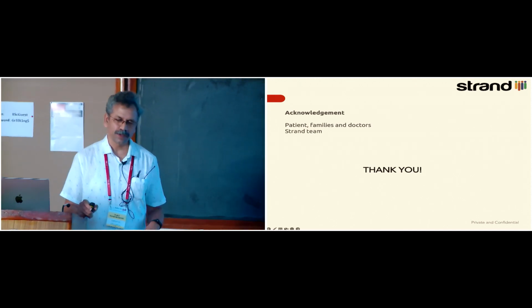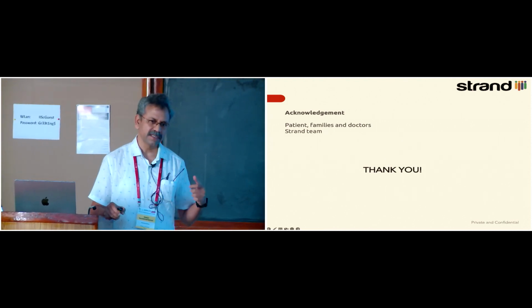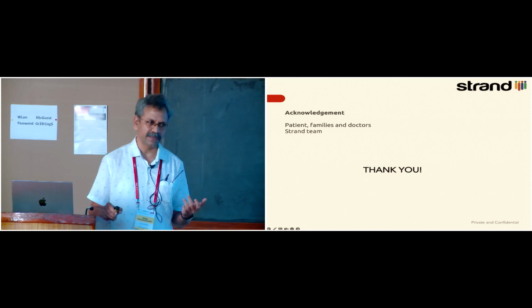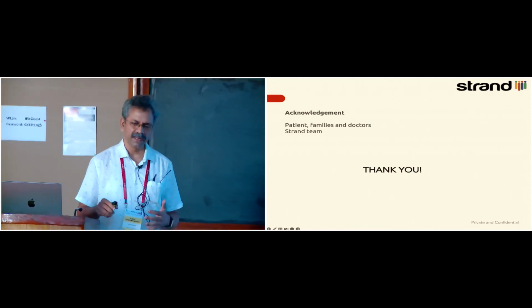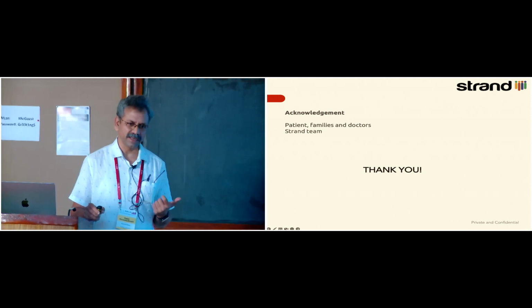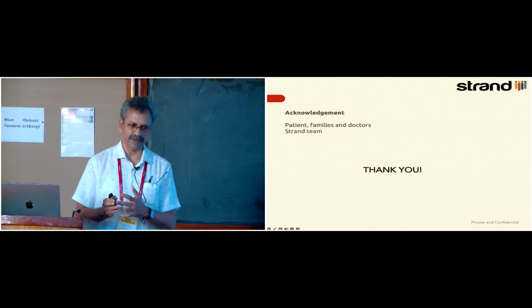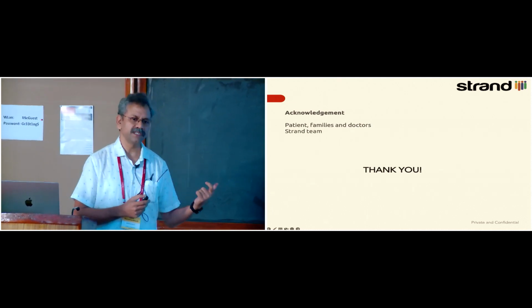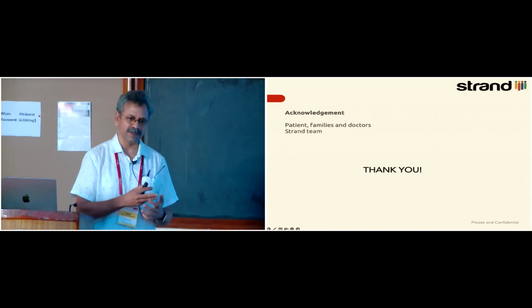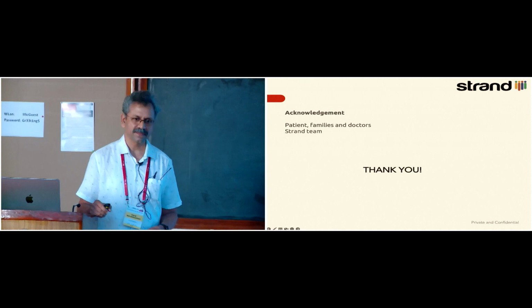And when you talk about normal, all of the data that we process goes into a central database. So every variant that we find, we compare against 10,000 exomes that we've already processed in the laboratory. We are looking at rare Mendelian events, so we don't expect it to be common in our database of 10,000, and that forms the normal. So for any individual gene, there's a lot of normal, though every individual might have a lot of abnormal things. Okay, got it. Thank you.